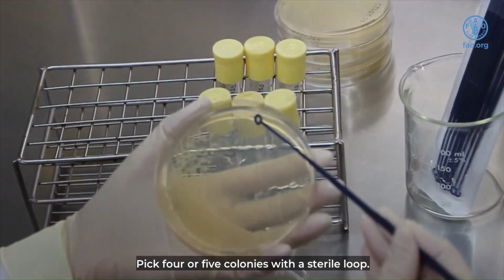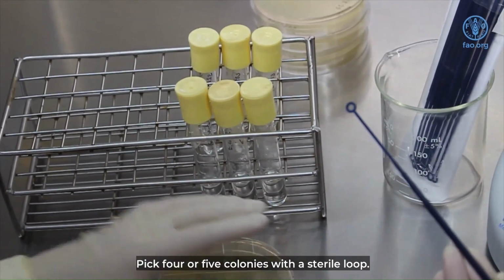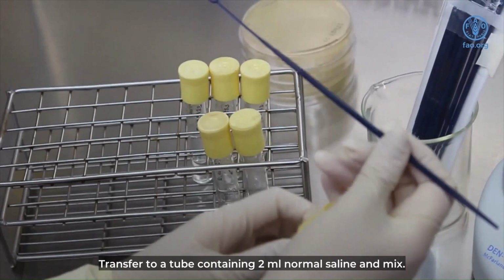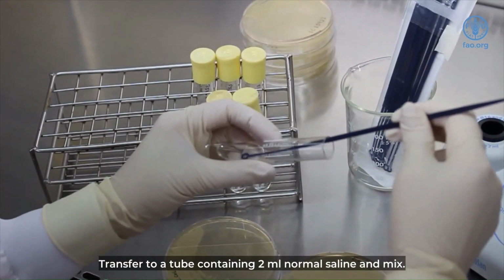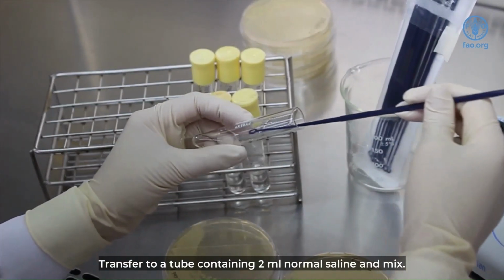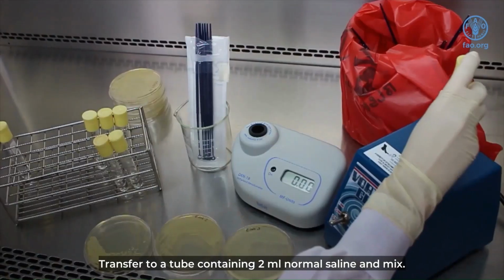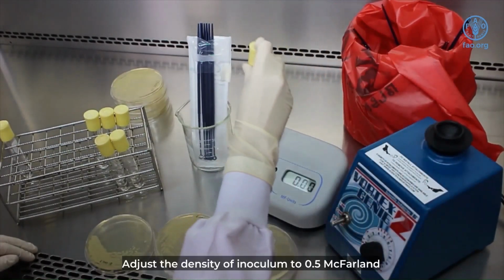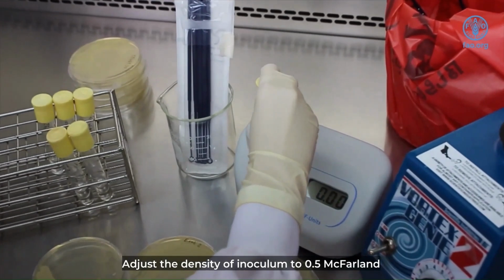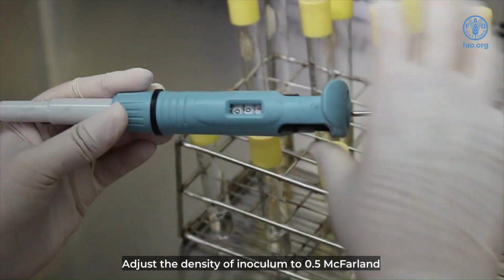Pick 4 or 5 colonies with a sterile loop. Transfer to a tube containing 2 milliliters normal saline and mix. Adjust the density of inoculum to 0.5 McFarland.